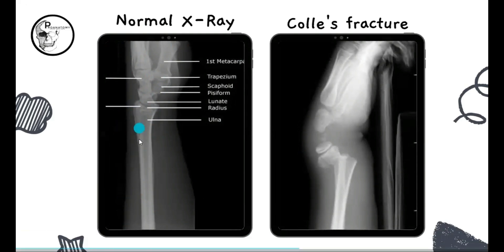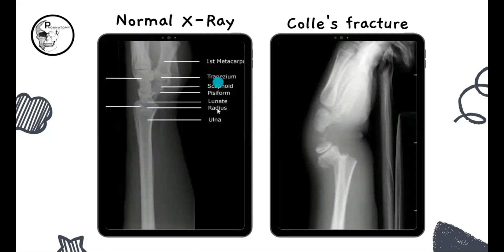And even the bone — if you observe the margins, they are very clean and there is no discontinuity in the margin of the bone. And this is the lower end of radius. So this is the normal X-ray.